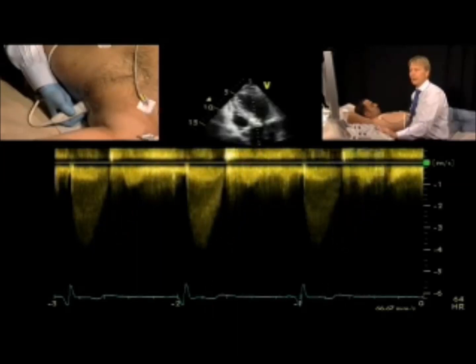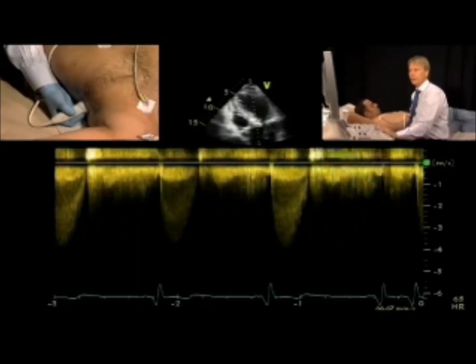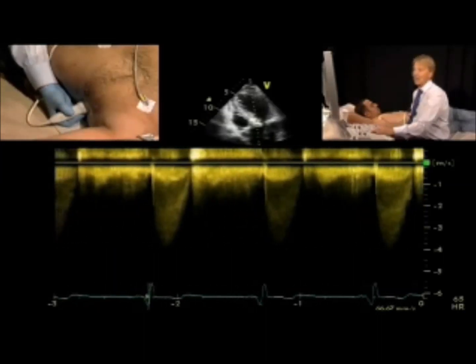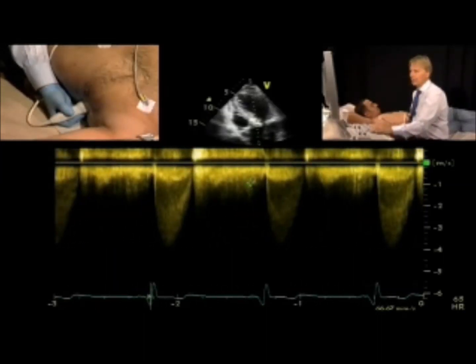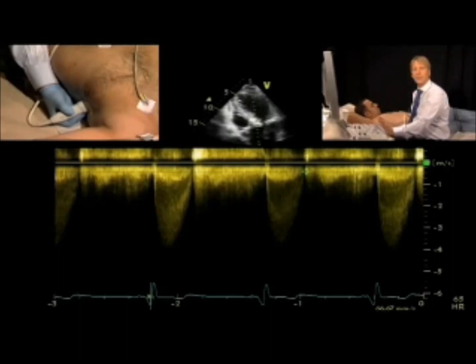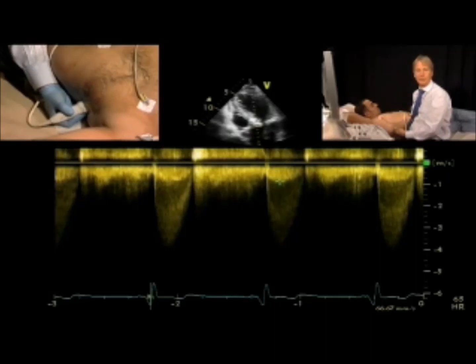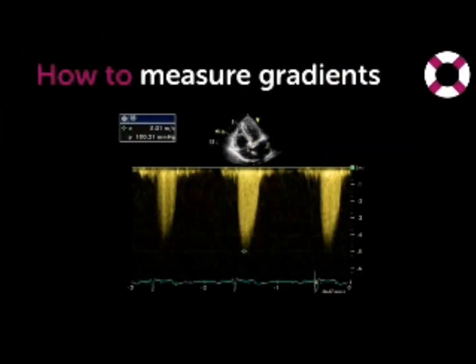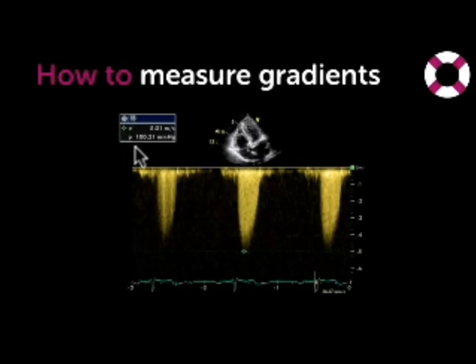From this optimized position, wait for a beat that is high and then measure the gradients. Also, it's important to see the LVOT within the curve — this confirms you have the aortic valve signal and indicates an optimal Doppler position. Once you have such a signal, place the cursor at the tip of the curve to measure the maximum velocity, which in this case is five meters per second, and the machine will automatically calculate the maximal gradient using the Bernoulli equation.